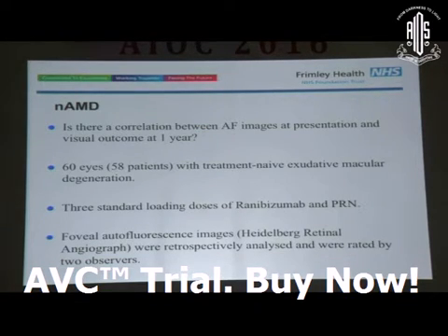Now, what about neovascular AMD? I mean, is there any use of fundus autofluorescence in neovascular AMD? Again, it can be used in trying to give a patient a prognostic indicator. It was Alan Bird who came up with this, who had done a study on a series of patients who had neovascular AMD, looking at the autofluorescence patterns and deciding whether there would be the prognostic indicator as visual acuity.